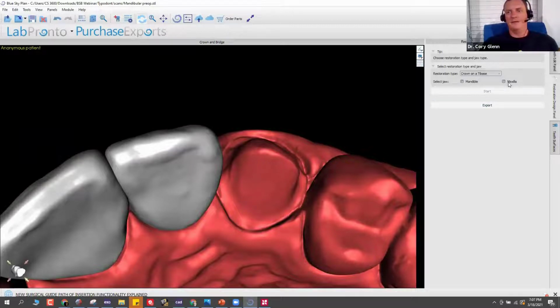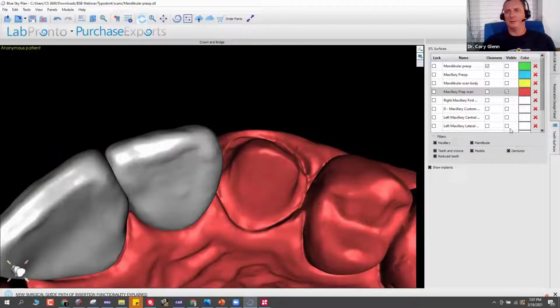And maybe, at the end, if we have time, we could pull up their website and look at that. The Envision Tech printer, again, is the Envision Tech E100 or something like that. I don't remember, it's some name with some letters and numbers. So I don't remember it off the top of my head, but it's an excellent printer as well. I'm not sure on the cost, but I think it's sub $10,000.